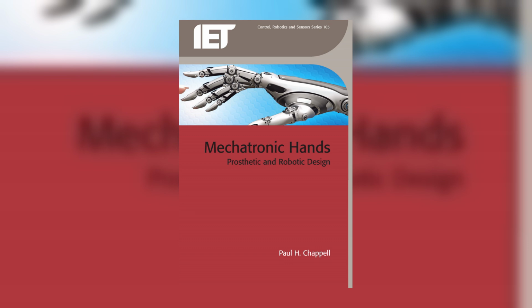Control is thus the composition that converts a person's command into force, while spending as little of their attention as possible. The same negative feedback primitive recurs at every level. Only the controller's identity changes: silicon below, brain above. This section explains the 4th body, control, the 4th chapter.